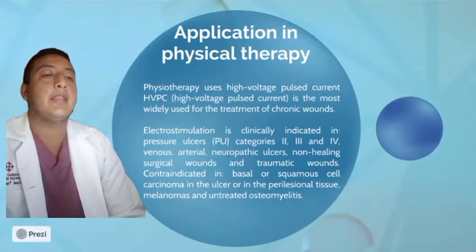Contraindicated in basal or squamous cell carcinoma in the ulcer or in the perilesional tissues, melanomas, untreated osteomyelitis.